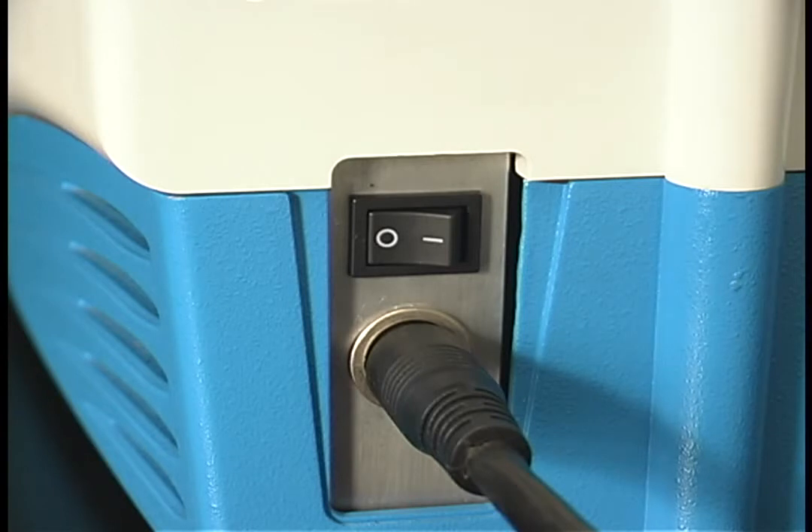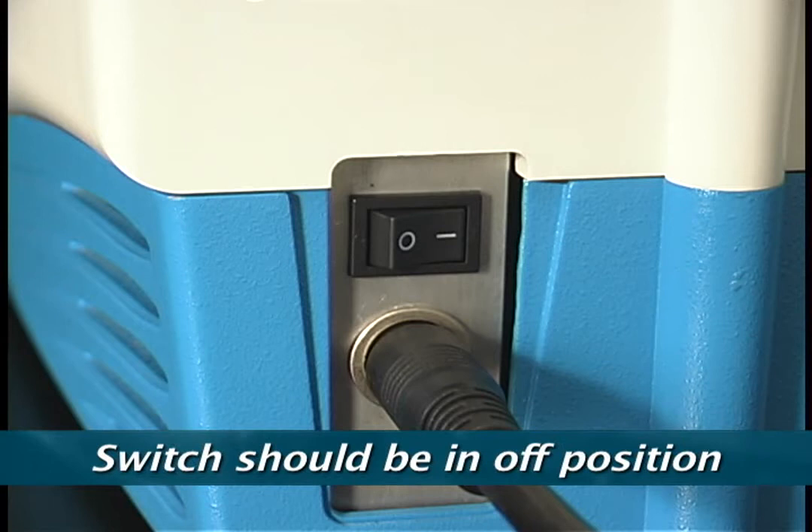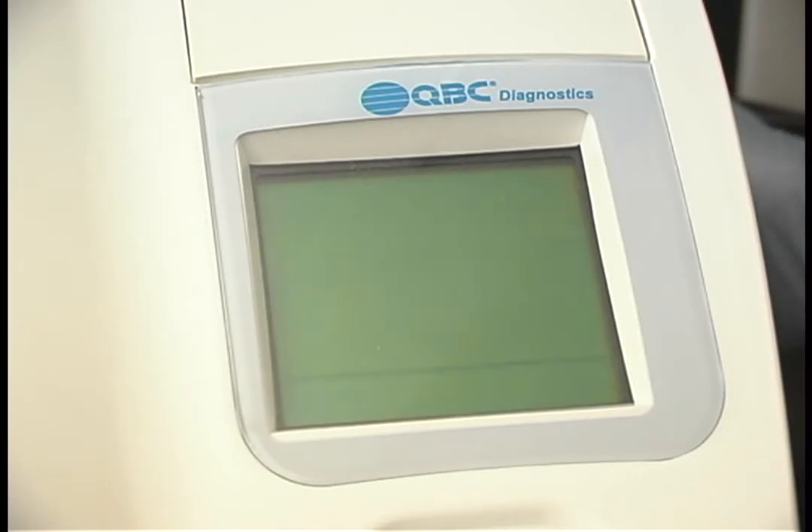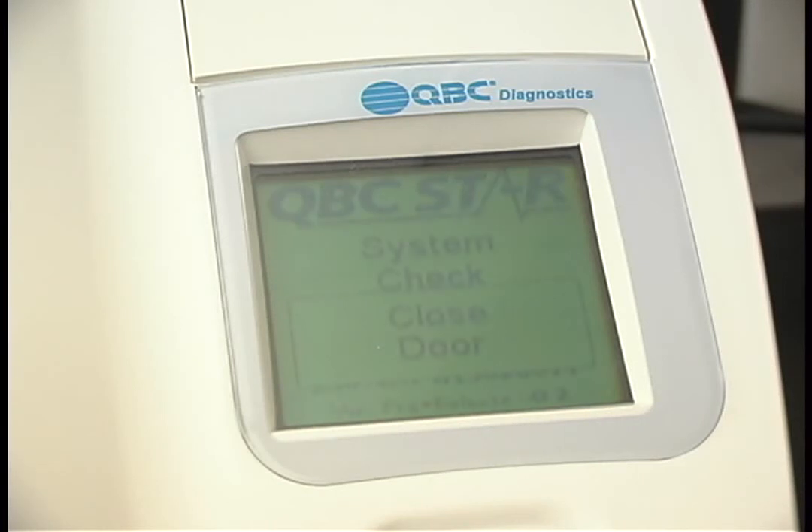Locate the power switch on the back of the unit and turn the unit on. It's important to note that the switch should be in the off position until the unit is properly plugged into a wall outlet. The display screen on the STAR will first read, 'System Initializing, Please Wait.' Next, it will check to see if the STAR door is closed before beginning the system check. If the lid is open, the display screen will read 'System Check, Close Door.' If the lid is already closed, the STAR will skip this prompt.